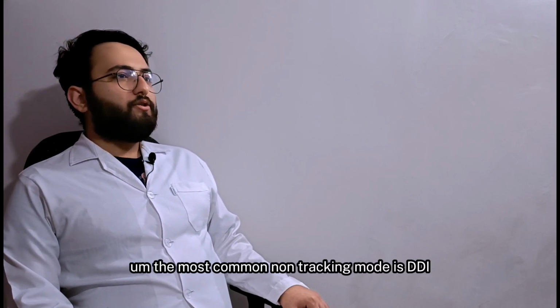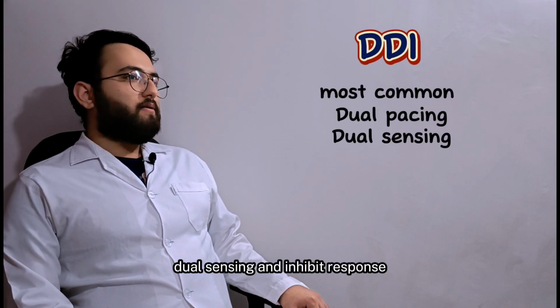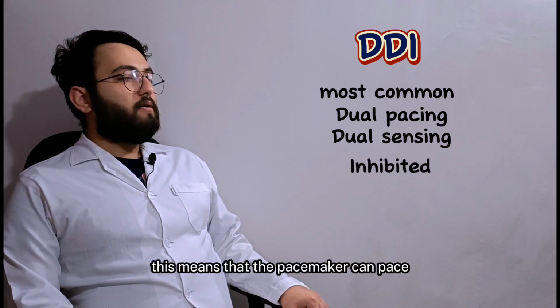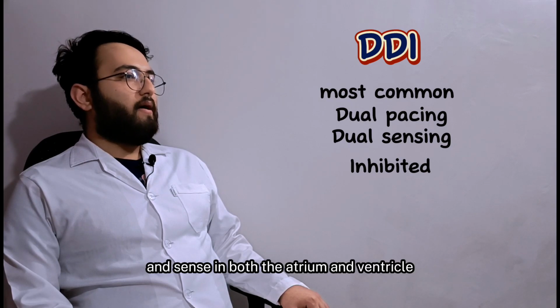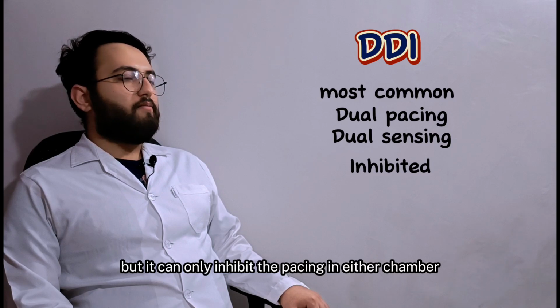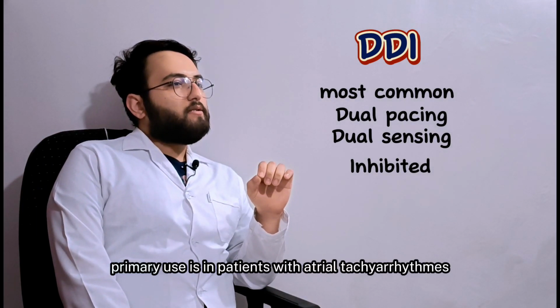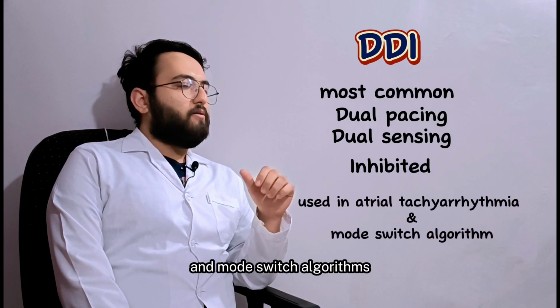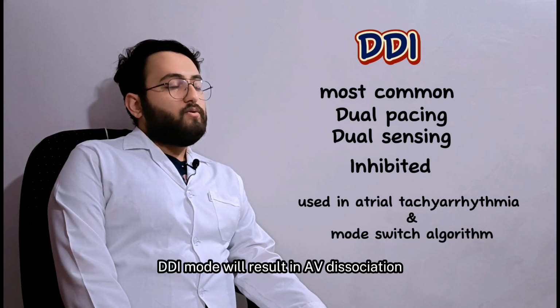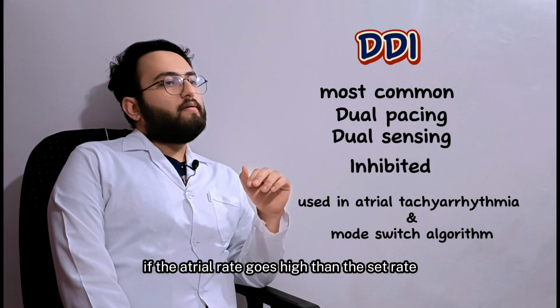The most common non-tracking mode is DDI. This stands for dual pacing, dual sensing, and inhibit response. This means that the pacemaker can pace and sense in both the atrium and ventricle, but it can only inhibit the pacing in either chamber. This mode's primary use is in patients with atrial tachyarrhythmias and mode switch algorithms. DDI mode will result in AV dissociation if the atrial rate goes higher than the set rate.